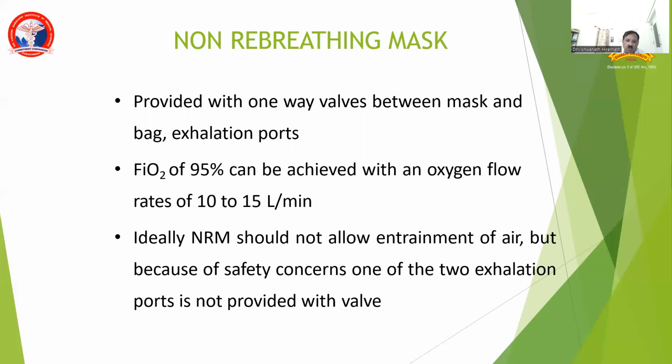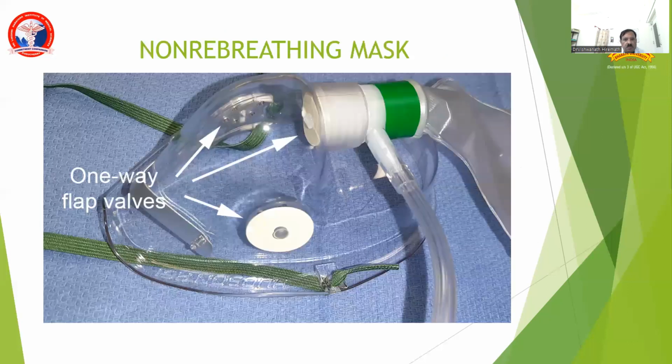Ideally, non-rebreathing masks should not allow entrainment of air. But because of the safety concern, one of the two exhalation ports is not provided with the valve. So in case of emergency, there can be entrainment of the room air. One-way valve.